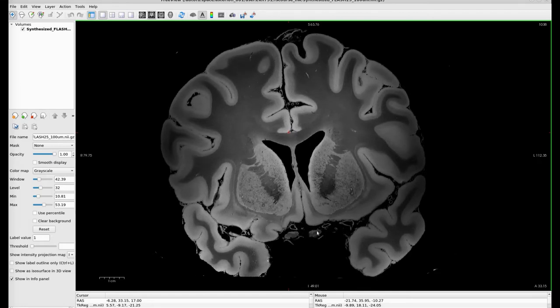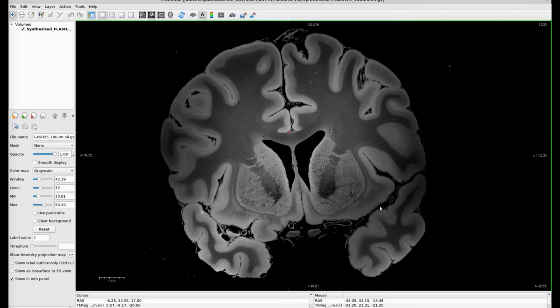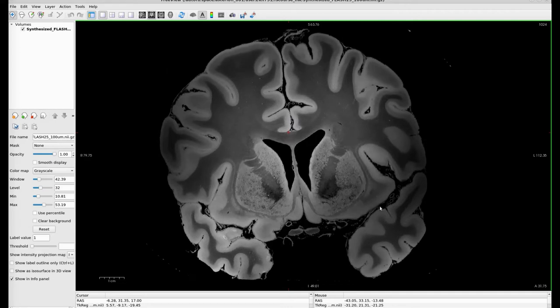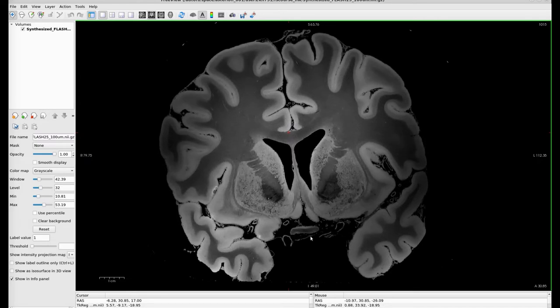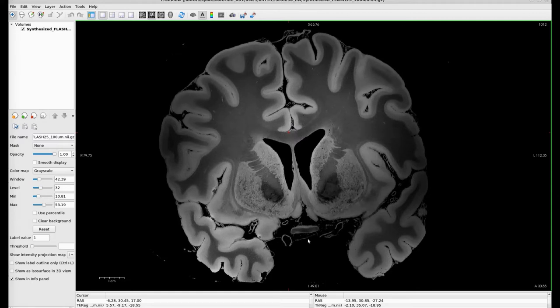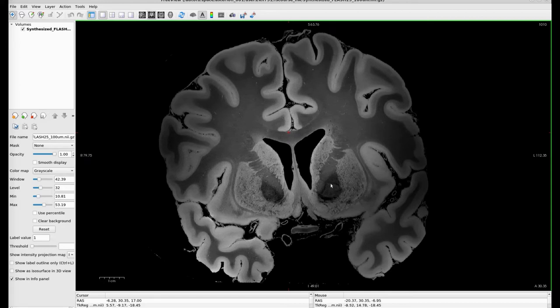We see the optic nerve right here, and as I keep scrolling, I will also point out the optic chiasm is beginning to form here. So anything anterior to the optic chiasm is called the optic nerve, and posterior to the optic chiasm is called the optic tract — we will see that in a bit. Now we're starting to see the globus pallidus come in here in the internal capsule. We've still got the putamen here, the nucleus accumbens, and the caudate is starting to get smaller. We've still got the lateral ventricle visible here.